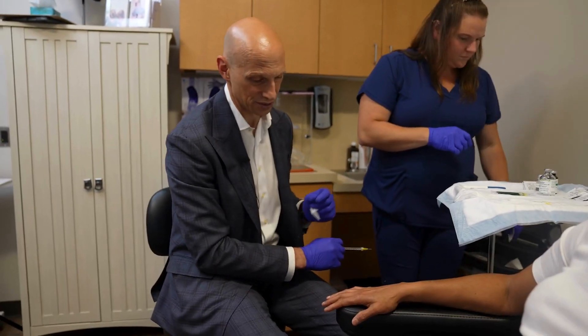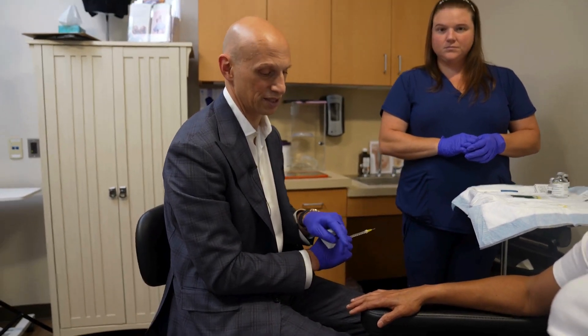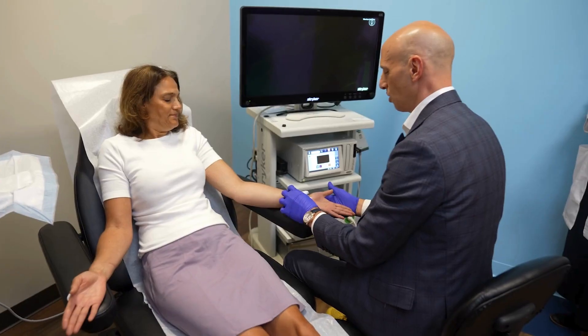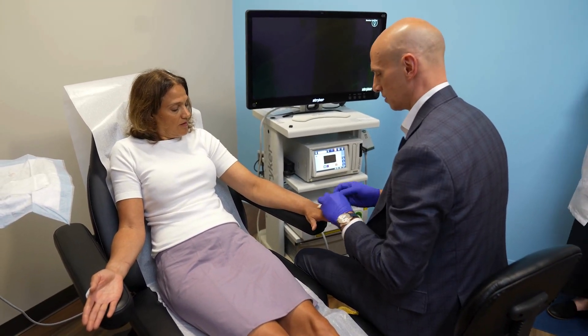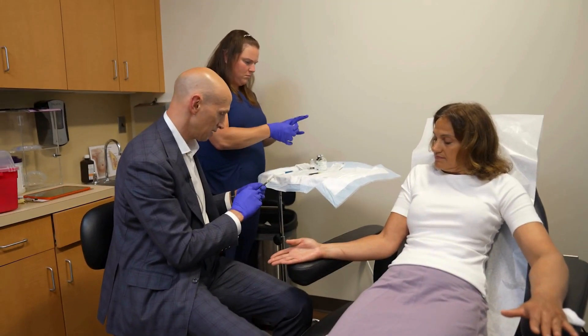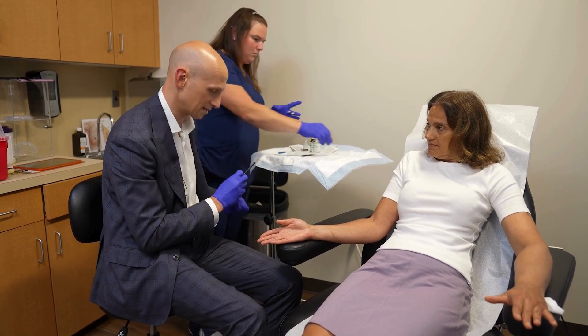It involves three injections. We use the tiniest needle, and the first injection is the lidocaine to numb the area. The second injection is the actual dye, which you won't feel. How did it go — did you have much pain? No, not at all. It's just a little pinch that you feel. This is the actual dye. We inject the lidocaine so that this is not painful, otherwise this can sting.